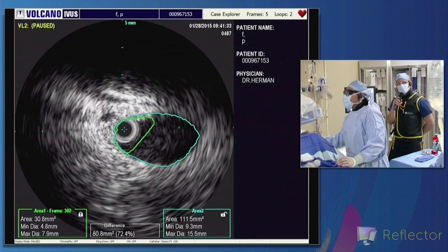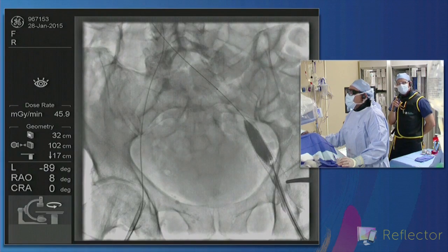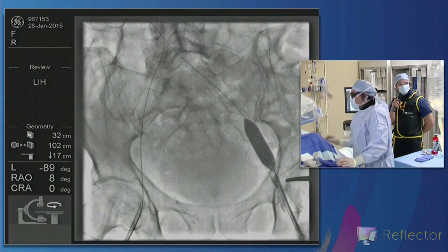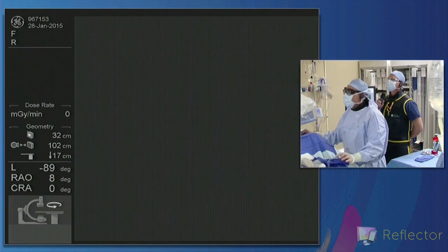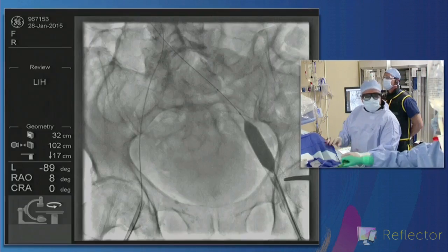You may feel a little pressure, sir. Yeah, I think that'll be great. As soon as we see this IVUS, we'll go to the next presentation, then come back to you, and we'll have about 10 minutes. Perfect. I know there's a lot of interest in PE. We'll take that down. I'm just going to balloon the lower portion just slightly. We'll have the IVUS ready to go.